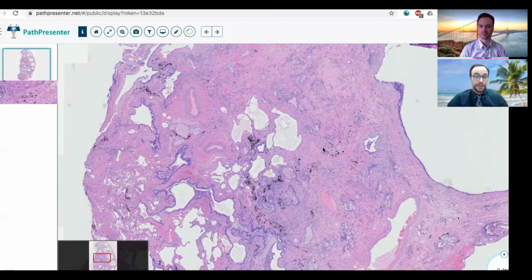So I think you did a great job, and hopefully you learned something about interstitial lung disease here, and we'll keep going with other cases. And it's great to keep learning together, even because of COVID stuck at home.